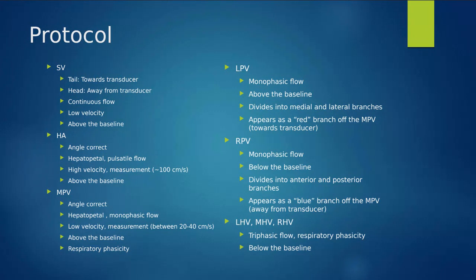And lastly, cirrhosis. We've talked about cirrhosis quite a bit. We know the difference between chronic and acute. We know how we get cirrhosis. On ultrasound, we can be doing an abdominal with Doppler exam, but we are more commonly sending patients for what we call elastography. And this is a different type of ultrasound application that we can use to actually test the density and the stiffness of the liver tissue. So it's a little bit more accurate than just doing Dopplers. Sometimes Dopplers don't really give us much more information. So we want to be testing that fibrosis of that liver tissue.